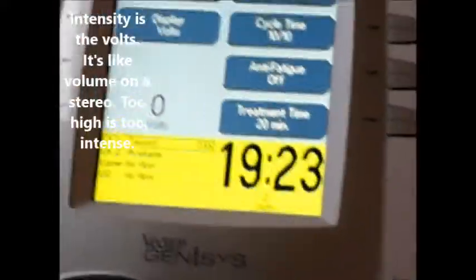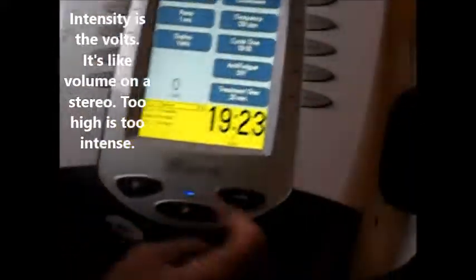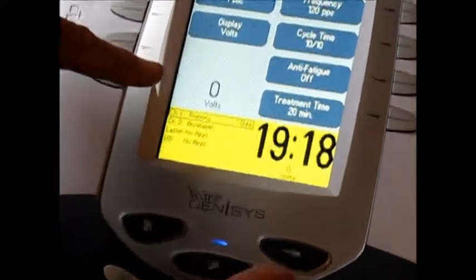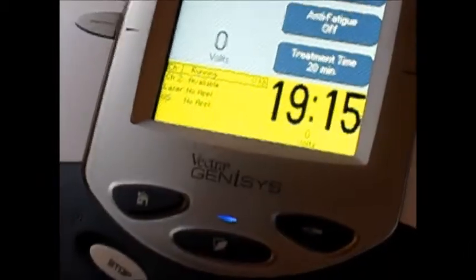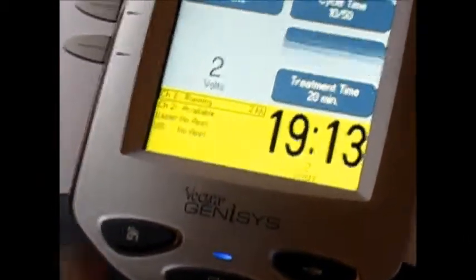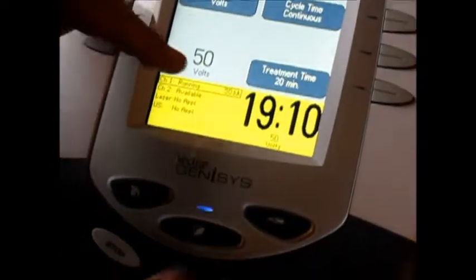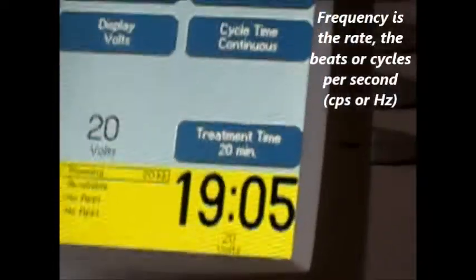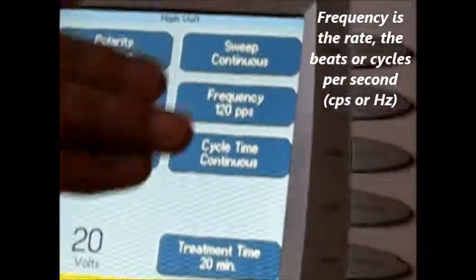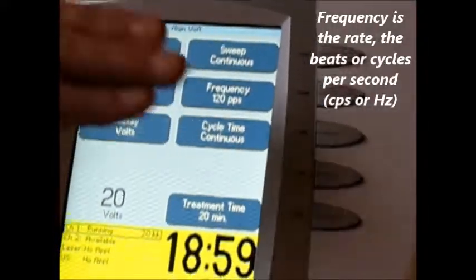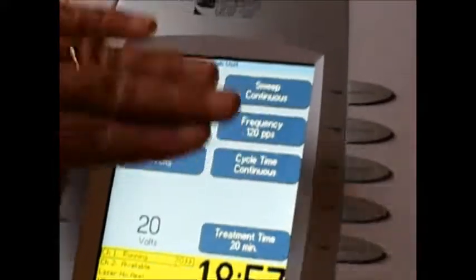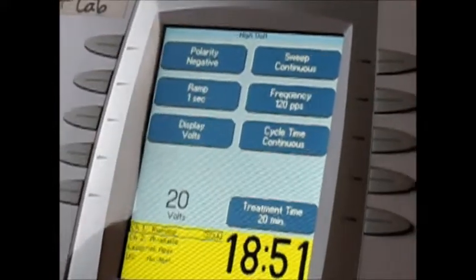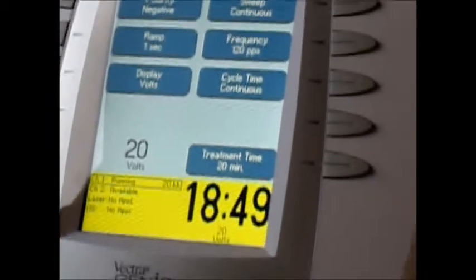Lastly, the difference between intensity and frequency: intensity is volts — that's how much the person feels the power, like the volume on a stereo. Frequency, however, is how much it will be on during a second: one beat per second, 10 beats per second, 120 beats per second — totally different things. So that's a summary of the HiVolt, and it should be pretty easy to use now. Thanks.